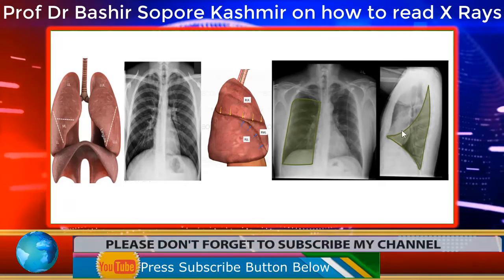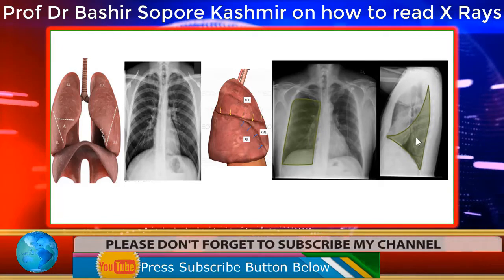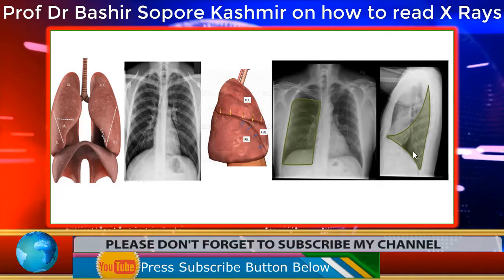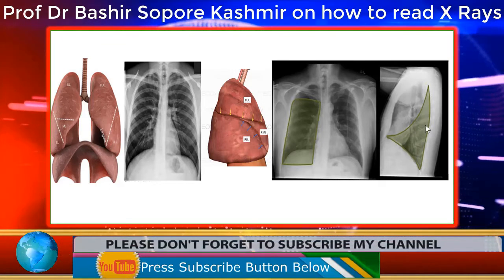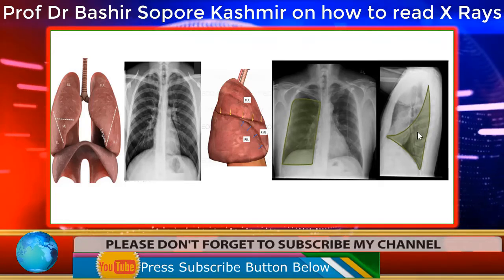This is the oblique fissure. So below the oblique fissure, this whole part is the lower lobe. So on lateral view, you may not be able to see this area, right? The costophrenic area or cardiophrenic area, or this whole area may become radio-opaque depending upon the size of the lesion.